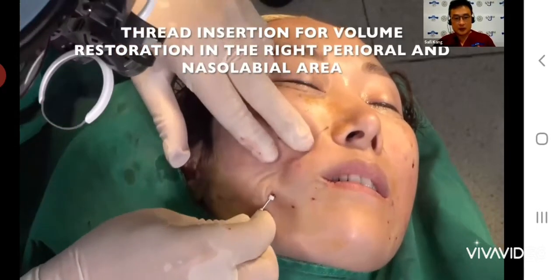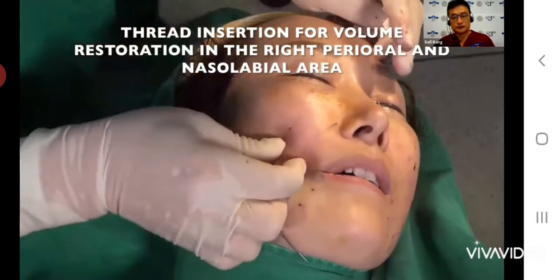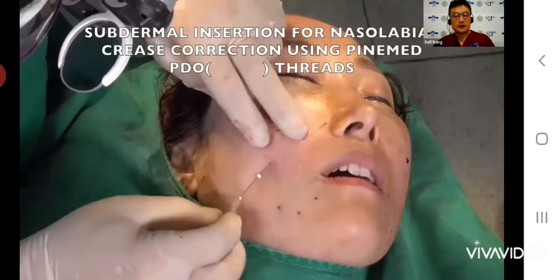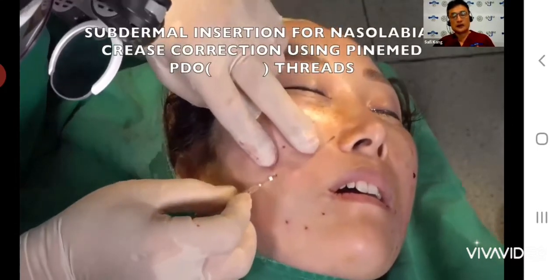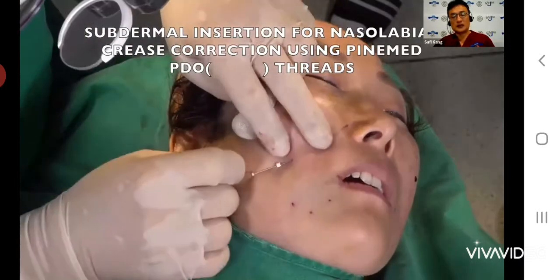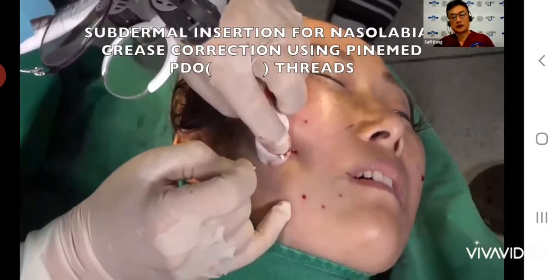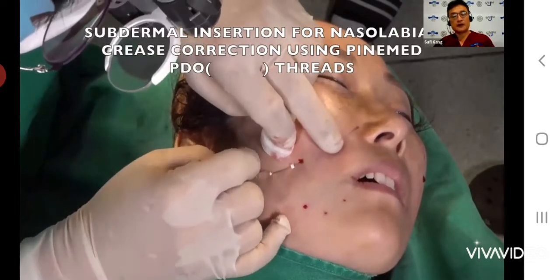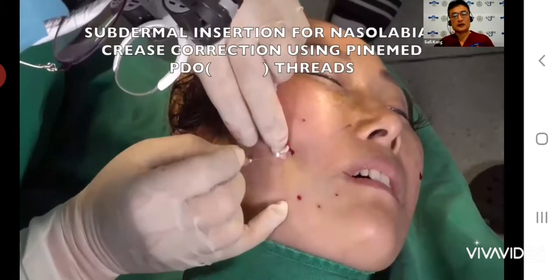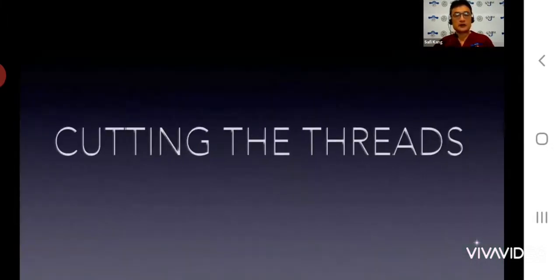You can decide the number, or you can decide the level of thread insertion too. And then touch again, and now on this side it is not only the deep soft tissue but also the skin. The skin thickness is different, so we should put a very fine thread for skin tightening and skin thickening too. So I insert the thread under the dermis.